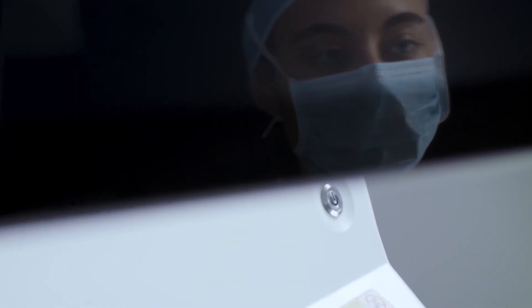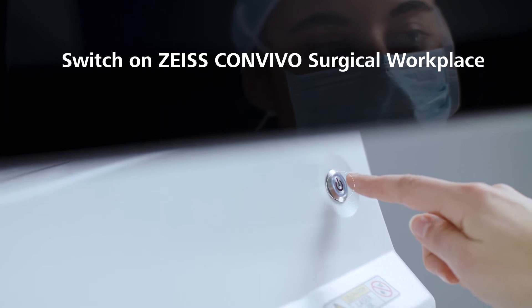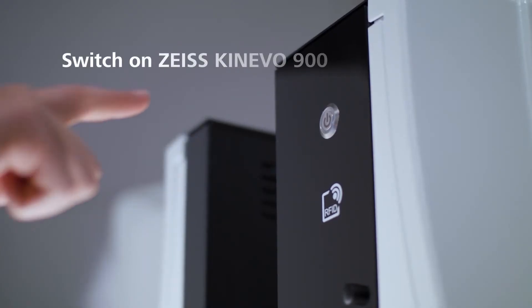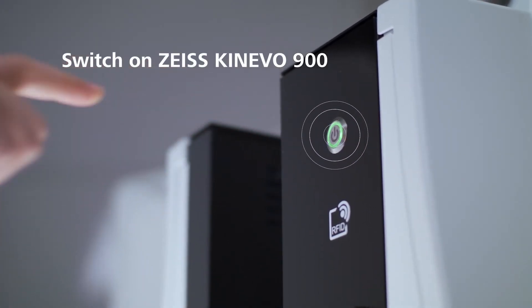When starting both systems, first switch on the Zeiss Convivo Surgical Workplace and then switch on the Zeiss Knievo 900.